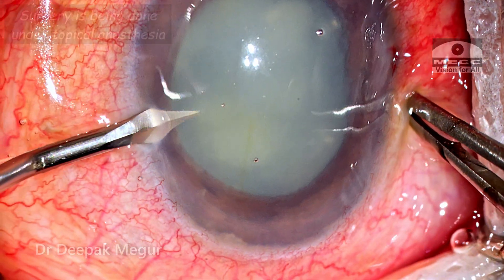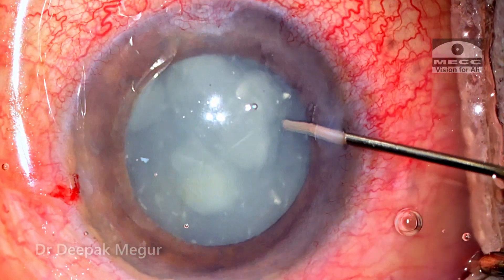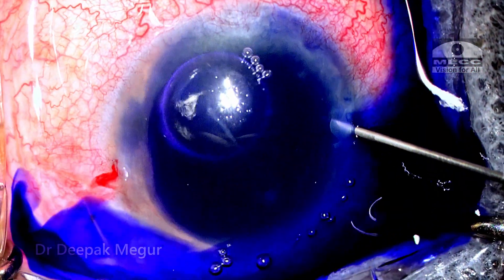Surgery is currently being done under surface anesthesia — topical drop support — and the patient seems reasonably comfortable. Intracameral lignocaine is used under an air bubble, followed by staining of the anterior capsule with trypan blue.